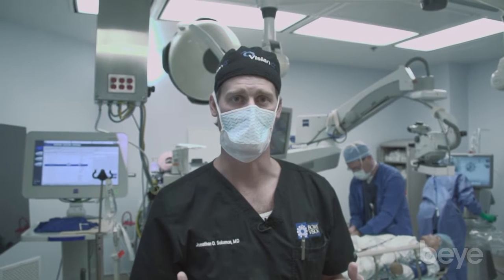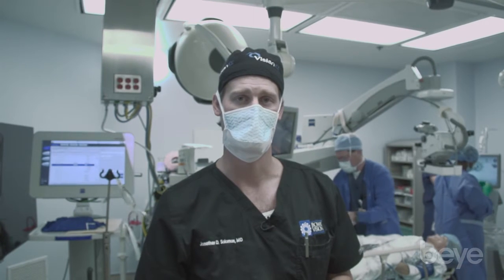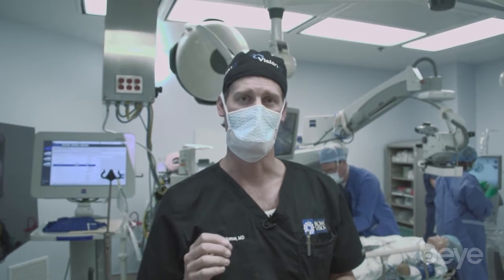Unlike a typical toric calculation where you enter information via an online calculator — say, an AMO calculator, which we use for the overwhelming majority of our lenses — we also like to use the Callisto system. Through a study soon to be published, we found that the biometry through the Callisto system is actually more accurate than if we were to run intraoperative aberrometry.